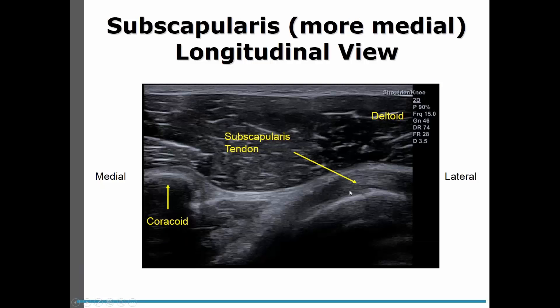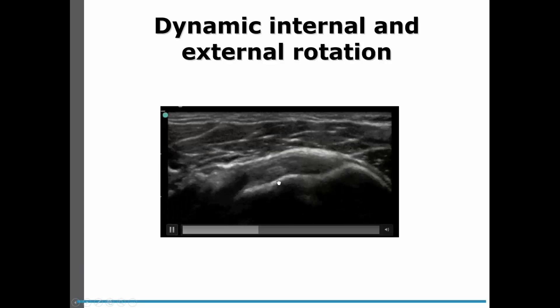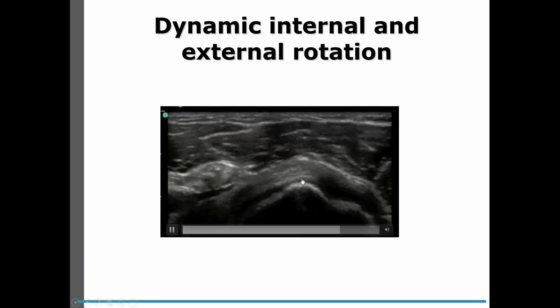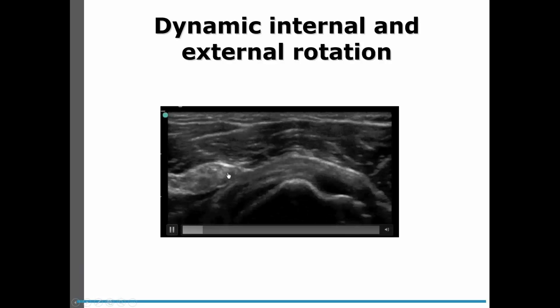As we move a little bit more medially, we still see the same image of the subscapularis tendon, but now we can also see our coracoid and we can see our coraco-humeral ligament. And if we do a dynamic view, we'll be able to see our subscapularis tendon sliding underneath the coracoid, or in this case, the tendons and ligaments coming off the coracoid.